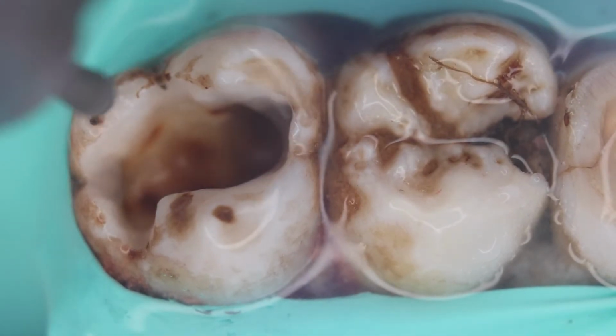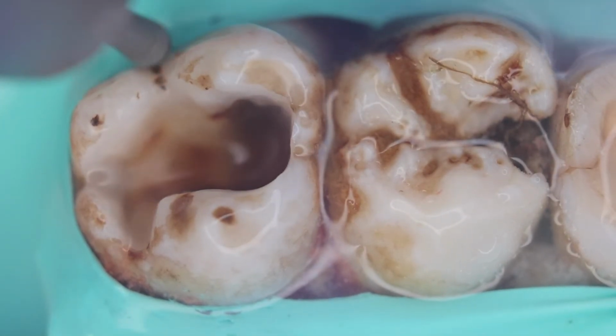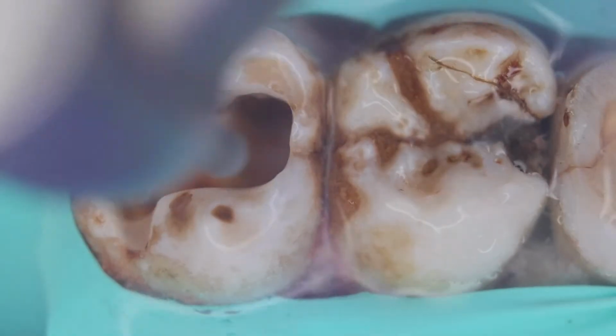Just remove the stains if you have. This is the finishing work. So you can just remove the stains if you want to consider removing them.